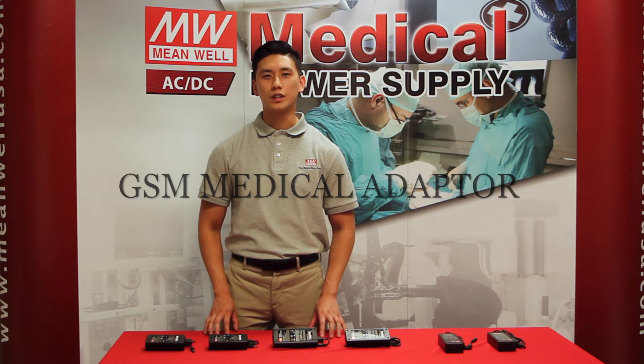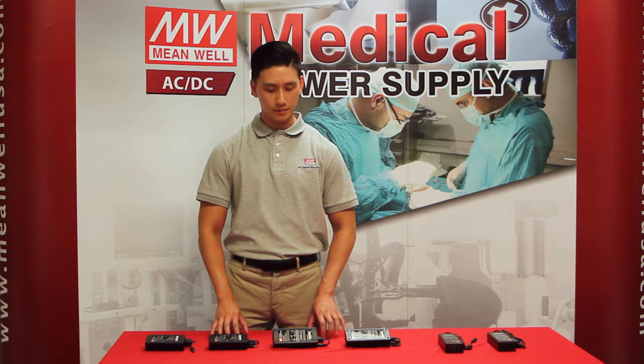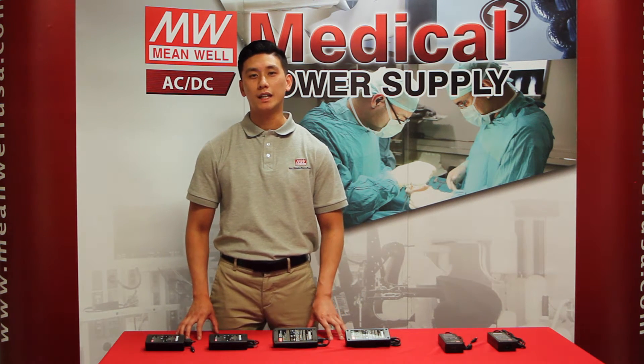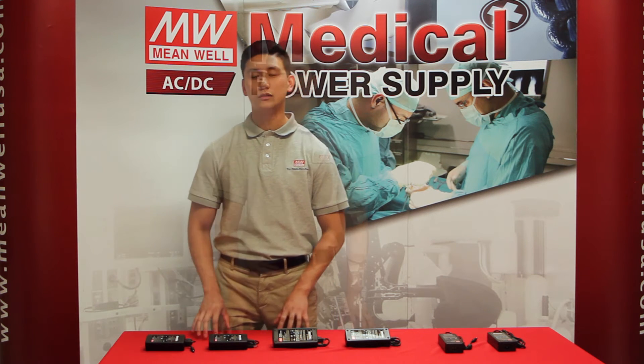Over here we have four different types. We have a 40 watt, a 60 watt, a 90 watt, and a 120 watt. Each wattage comes in a 5 to 48 volt output range and they are all medically certified to UL.